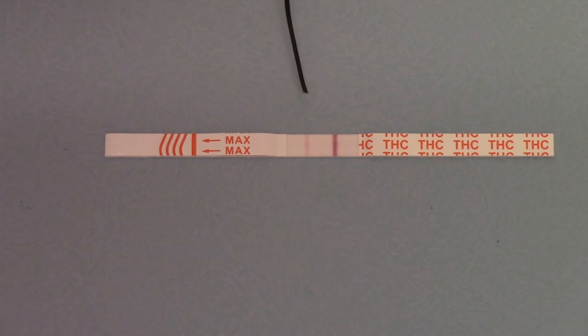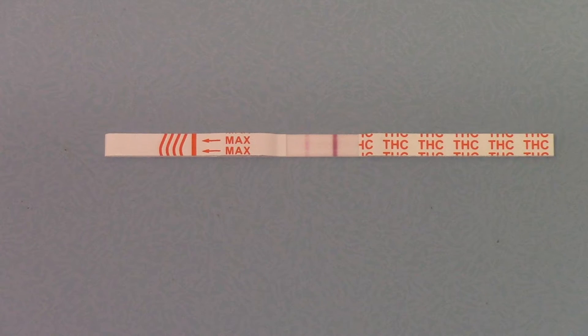and they can see the test line forming in that area — both the test line and control line clearly discernible — they would interpret that as a clear negative result and move on to the next sample. There is actually no requirement to wait for the full development time, other than in positive tests where no test line is forming.